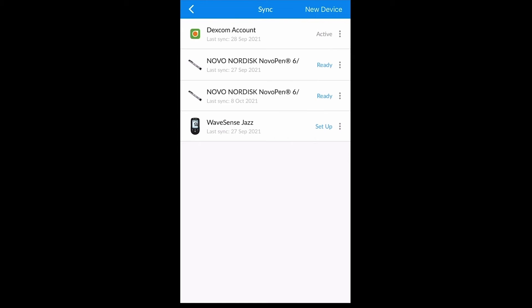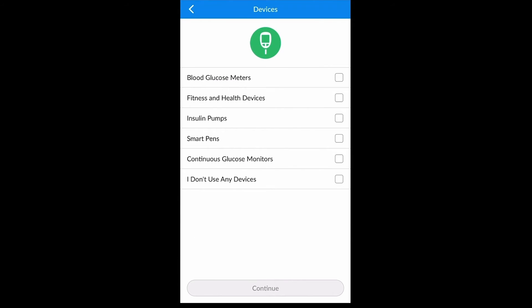Here you are able to select New Device. Next you must select the type of device that you would like to upload — in this case, a blood glucose meter.